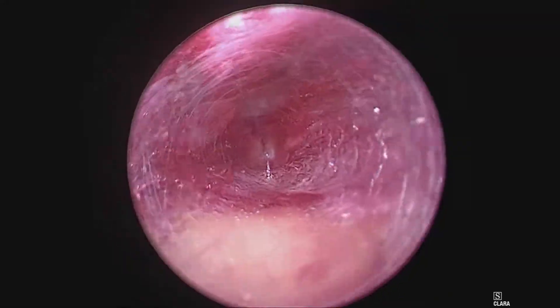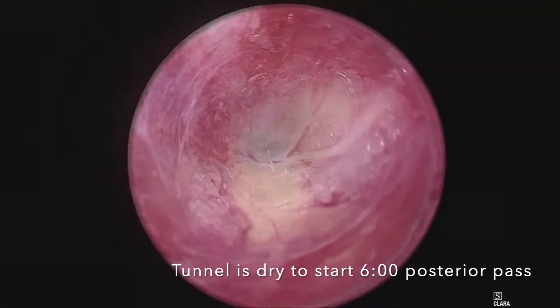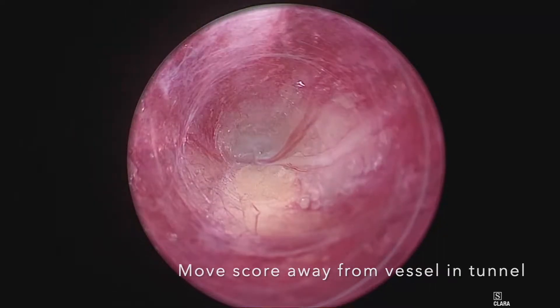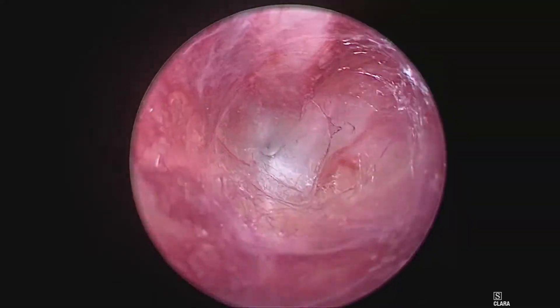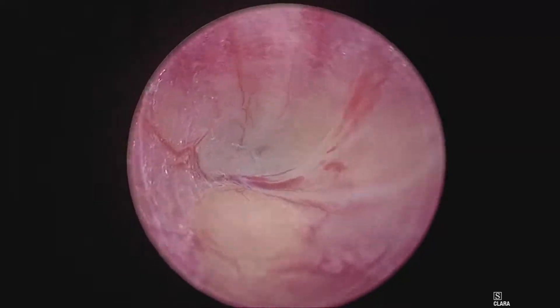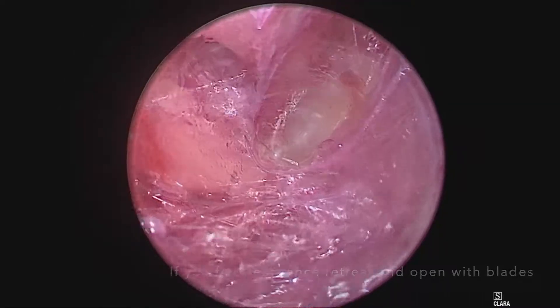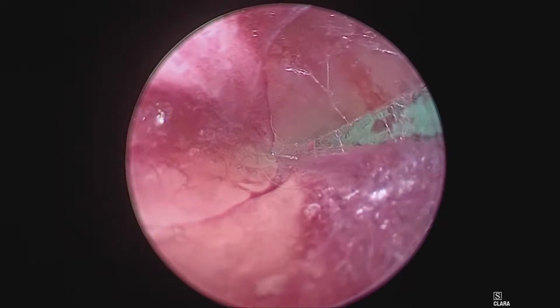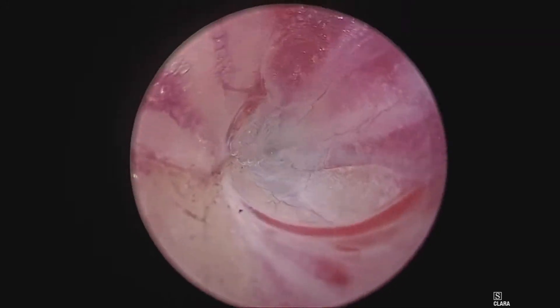Begin to dissect exactly at 6 o'clock. If you feel resistance and identify a vessel, rotate the scope from 6 o'clock to 9 o'clock or 3 o'clock and use your blades to open up the tunnel and reduce resistance. This technique reduces the chance of creating bleeding during your dissection. I'm using the blades to just gently open that tunnel where I had resistance.